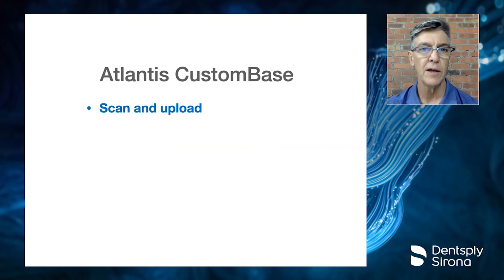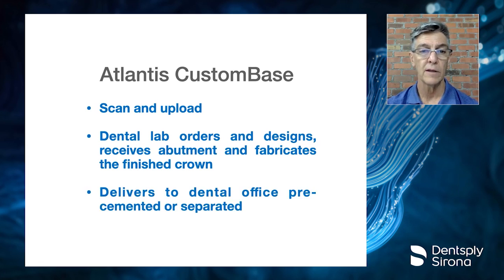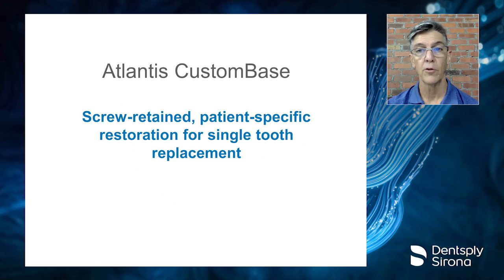So Atlantis CustomBase, basically we do this. We scan, we upload it to a laboratory. A laboratory then can order and design the abutment. They'll receive a design. They can then custom design it with the 3D editor, order the abutment. They receive it. They're going to make a final crown. At that point, they can decide, or you can decide, if the crown should be permanently cemented or sent to you in two pieces so that you can do the try-in approach as I do. It's your choice. They both work.